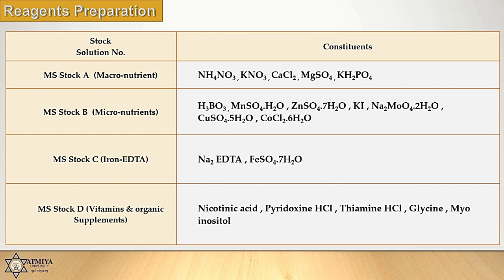To avoid any kind of error in weighing and to save time, it is better to prepare stock solutions of standard concentration and use them whenever needed to prepare the medium. The components of the different stocks are mentioned in this table. It's completely your choice how much volume of stock, and how many different stocks of inorganic and organic supplements, you prepare.